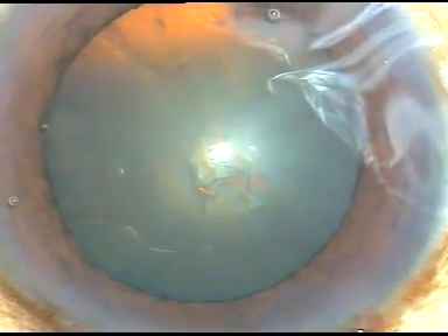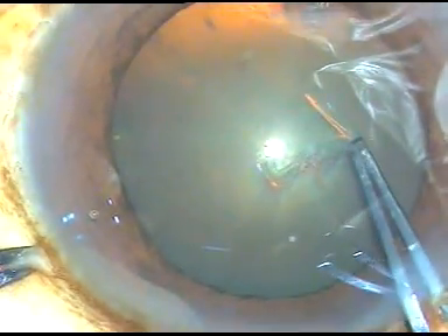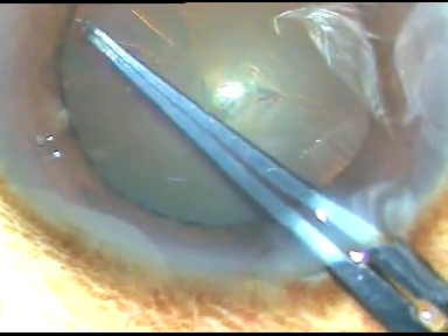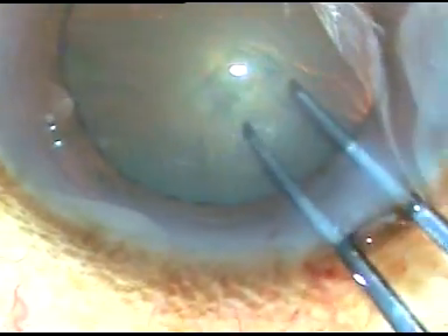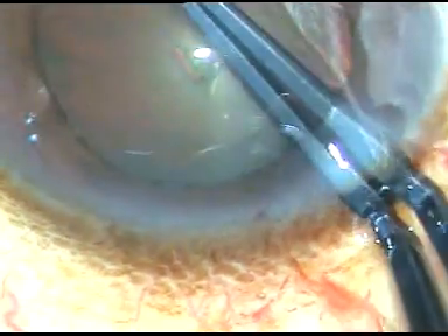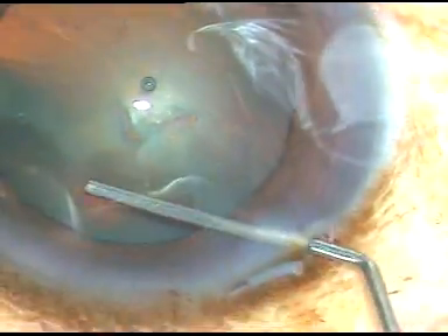I have done this in this case and let us see how it was done. This is capsulorhexis with utrata forceps. I hold the capsular tag with utrata forceps and go anti-clockwise to make the CCC — continuous curvilinear capsulorhexis. I try to remain at equal distance all around from the margin of the dilated pupil, and thus I get a good rhexis.